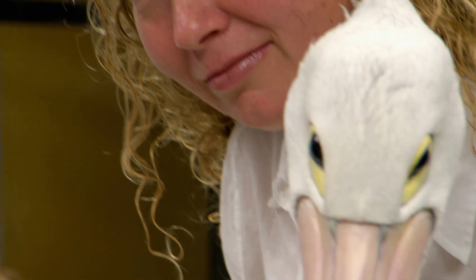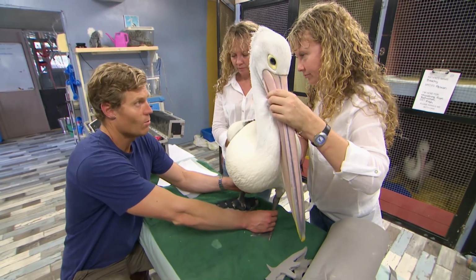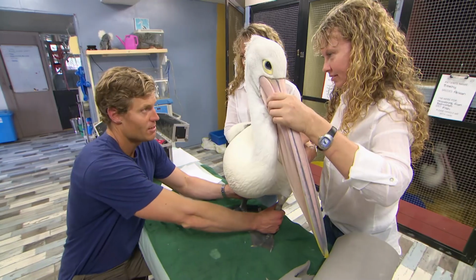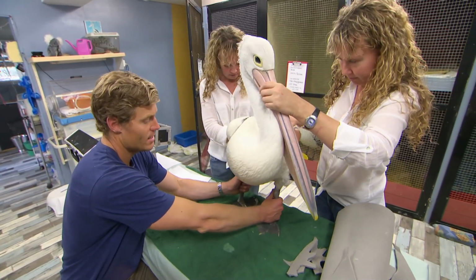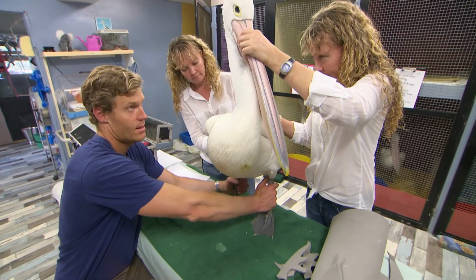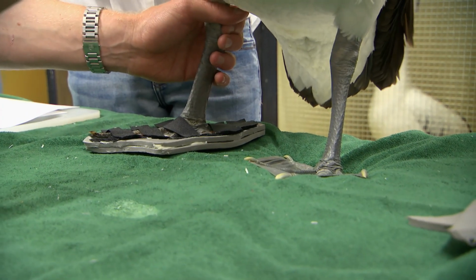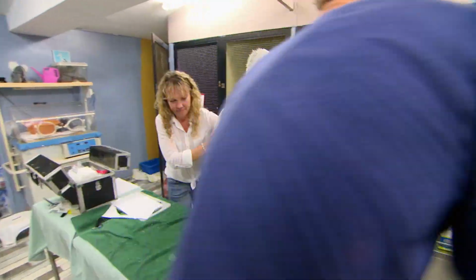So once she feels like this is how it's meant to be, and becomes her new normal, then she'll start taking the weight off this left leg and shifting it onto the right. Yes. And we can start doing that by lifting up the left leg. You see now, all that weight is through her right leg. Yeah. Really, a little bit of physio like that, and in the next few days, we should really start to see Flipper starting to walk more normally and spread that weight more evenly. And that would be a perfect result. Put her on the ground. Let's have a look. I'll move this away.